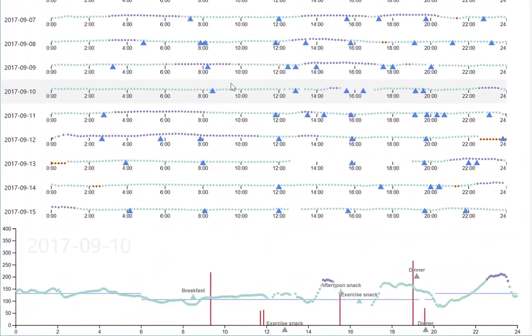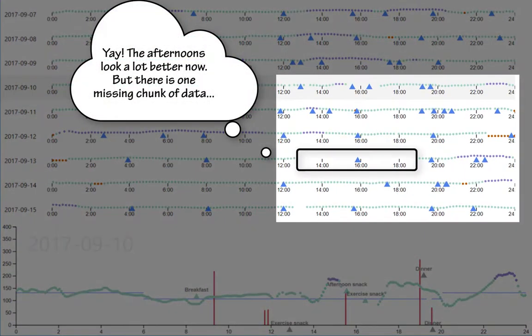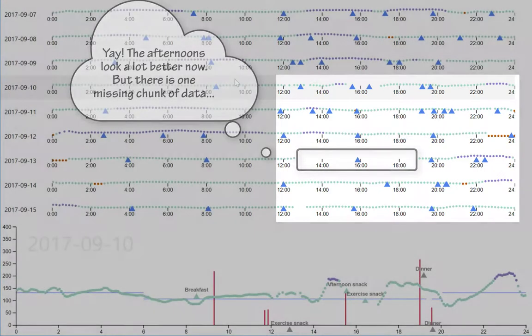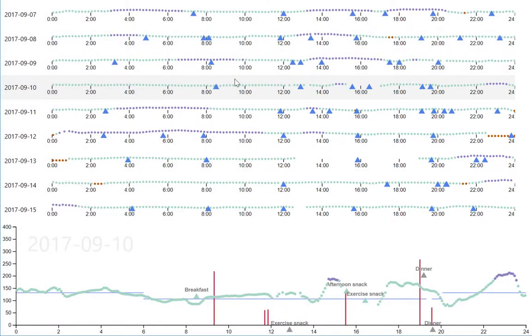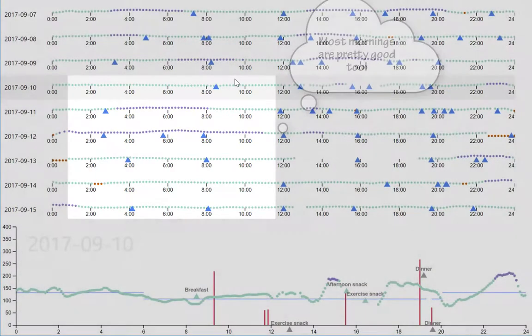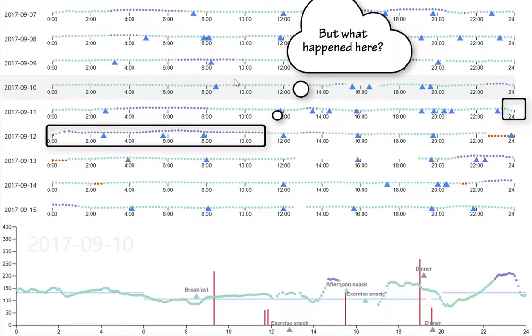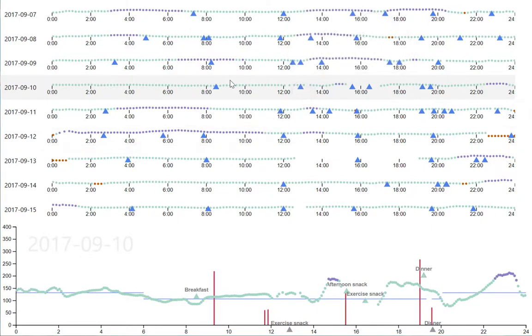Afternoons are doing much better now, but we see that the CGM cut out for the afternoon of the 13th. Mornings are doing pretty good too, but what happened on the 12th? There's a lot of purple dots, a lot of highs during that time period, and we see a low around midnight.